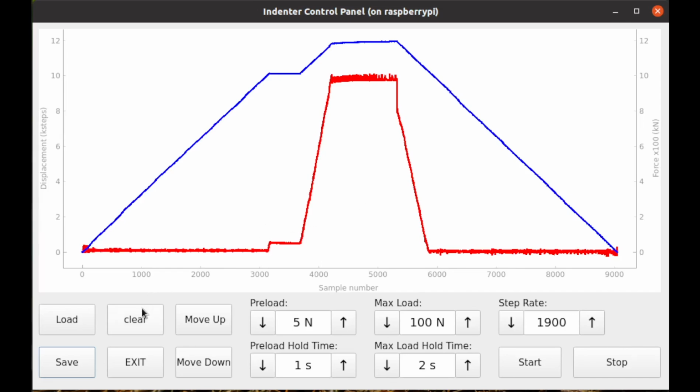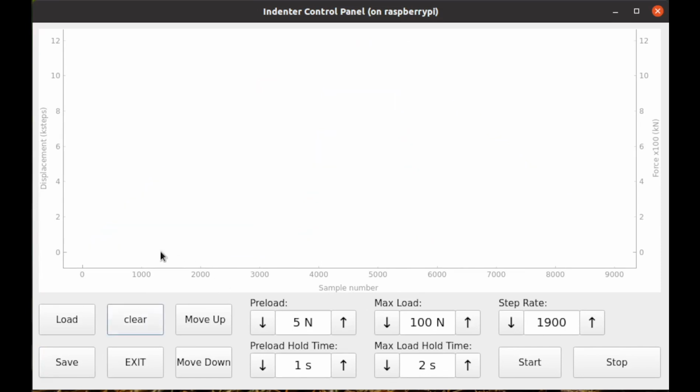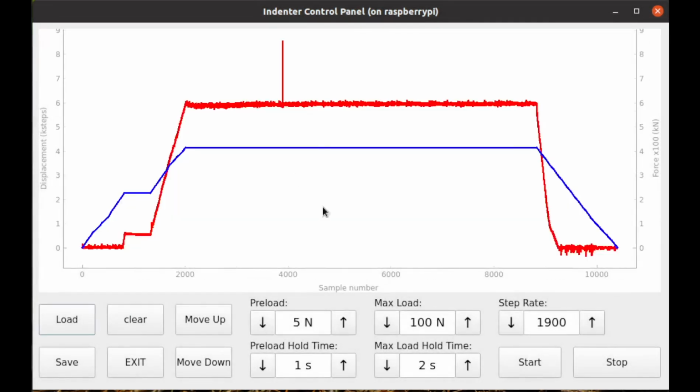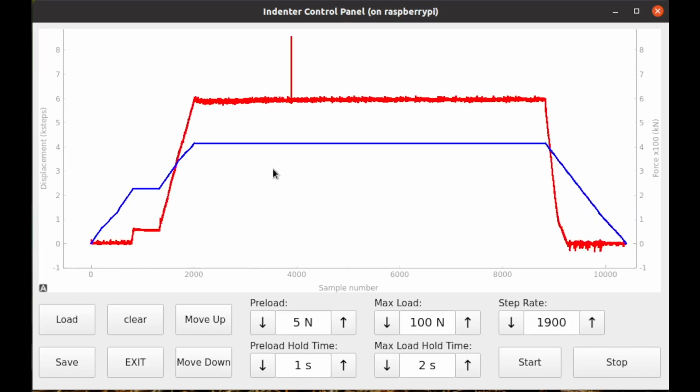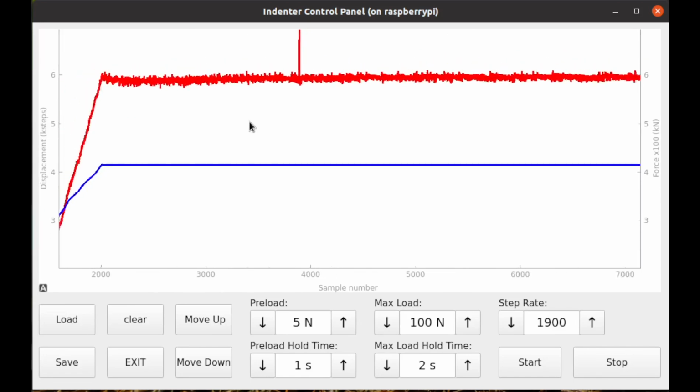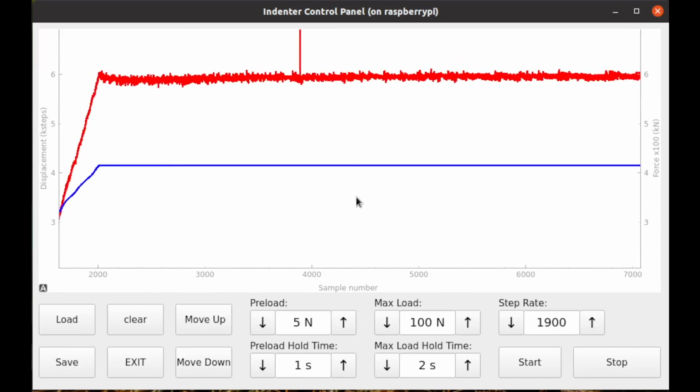This graph can now be cleared using the clear button, and the previously taken measurement can be loaded using the load button. Another feature of this graph is that it's very interactive. I can move it around to look at different data points, and also zoom in and zoom out. And once we are done taking the measurement, we can press the exit button to exit out of the indenter control panel window and go back to the Raspberry Pi desktop.